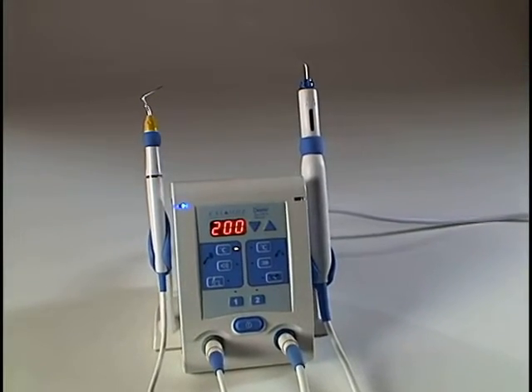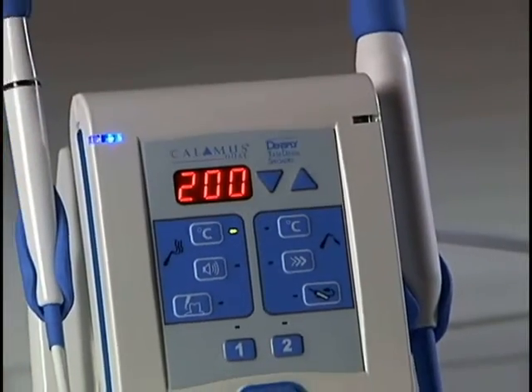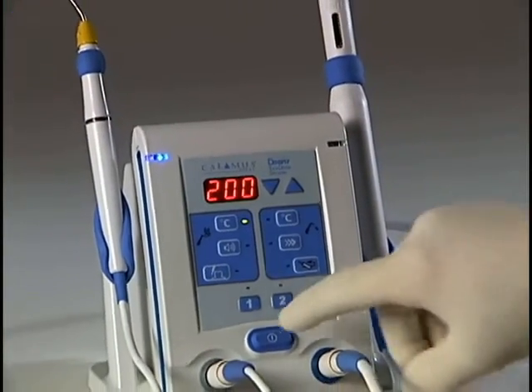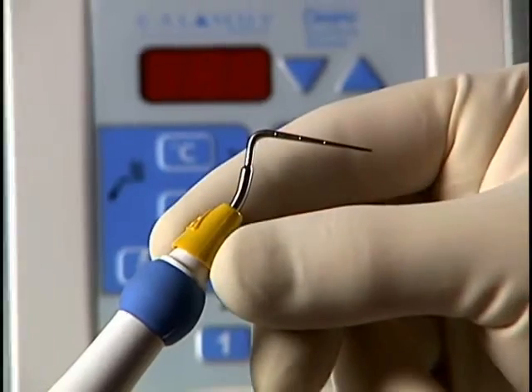Cleaning of any of the Calamus units is a simple two-step process. Make certain that the power is off and that the handpieces are sufficiently cooled down.